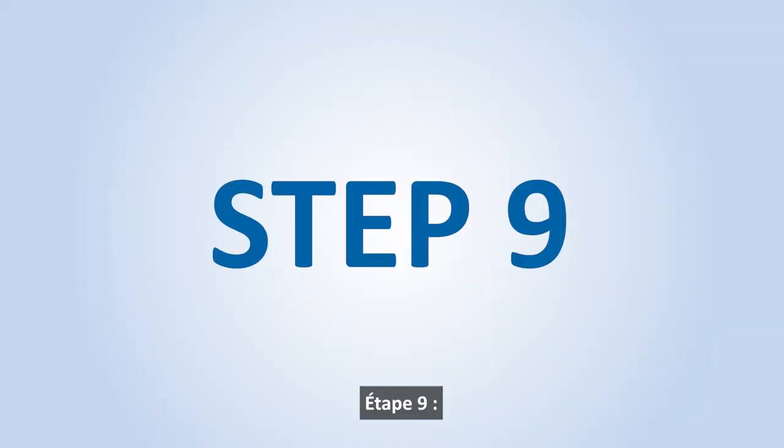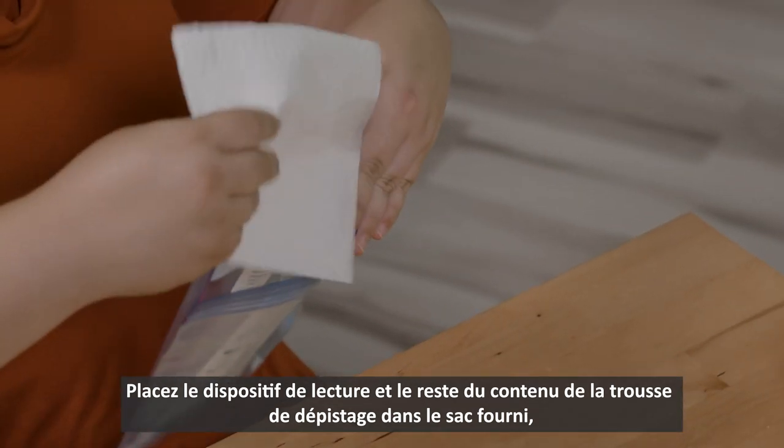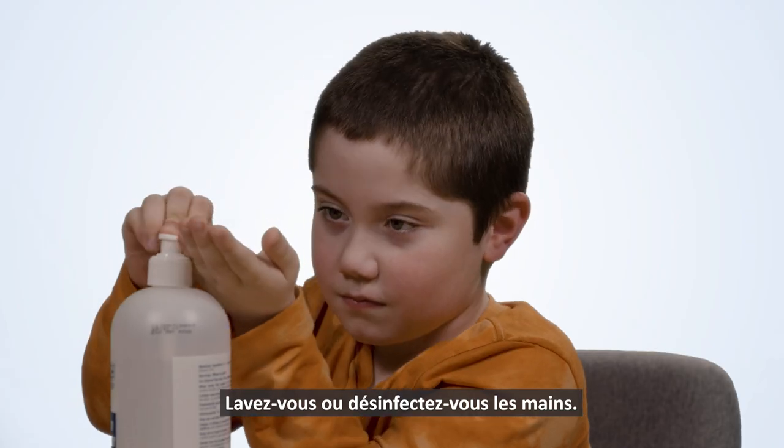Step 9. Place the test cartridge and all other testing components back into the bag you were provided. Seal it shut and dispose of it in your regular garbage. Wash or sanitize your hands.